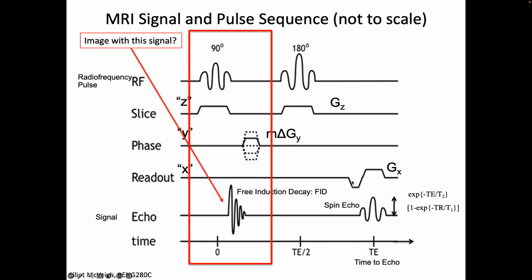And again, as we said last time, you cannot make this slew rate, or the switching of the gradient, faster than the physiological limit. It's sort of like G-forces in a fighter plane. You've got a human in the MRI scanner. If you switch these magnetic fields at a high enough rate, you will stimulate peripheral nerves, and the patient feels it. They're not that comfortable with it.